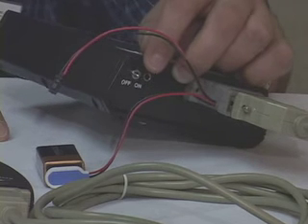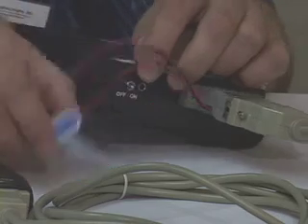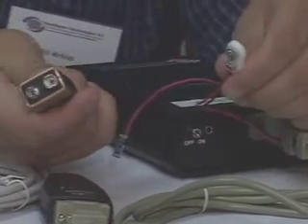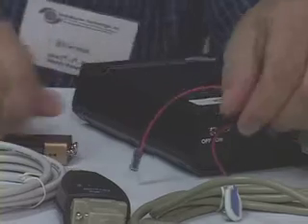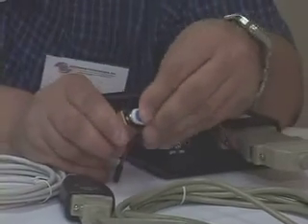If your unit has then charged for a couple of days and you feel it will run on its own, we want to simply unplug the 9-volt battery first, then we can switch it to on and detect if we have a red light. Off to use the external battery, on to use the internal battery.